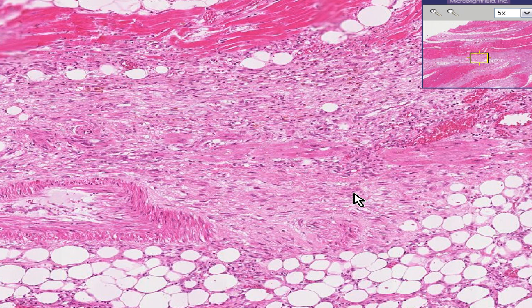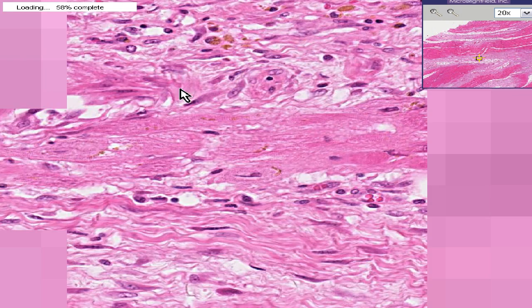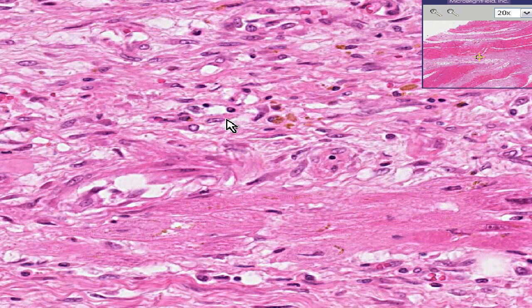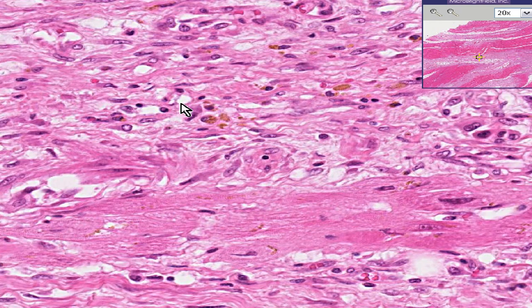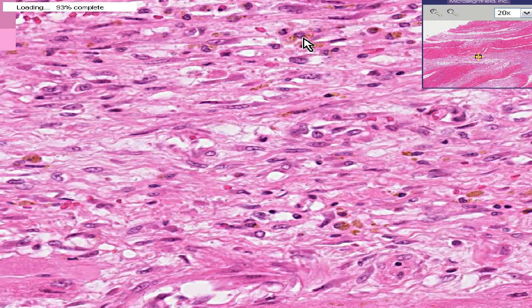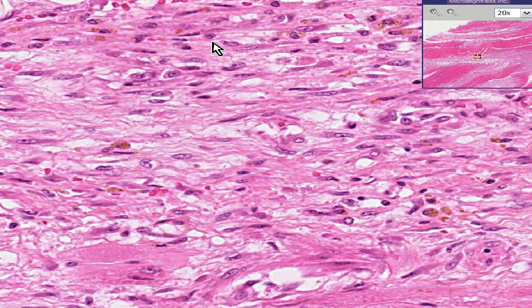This is otherwise known as organizing inflammation. The key features of granulation tissue, or organizing tissue, is the fact that it is a very vascular tissue, and it is abundant in macrophages as well. All of the cells that you see here that have granules in them are macrophages. That is one of the predominant cells of organizing inflammation.